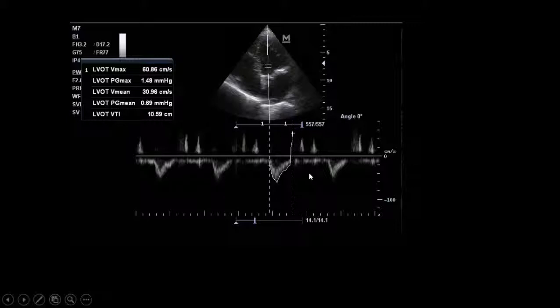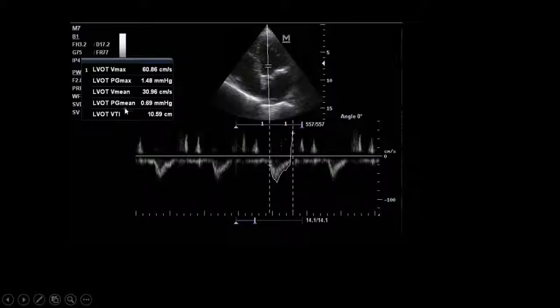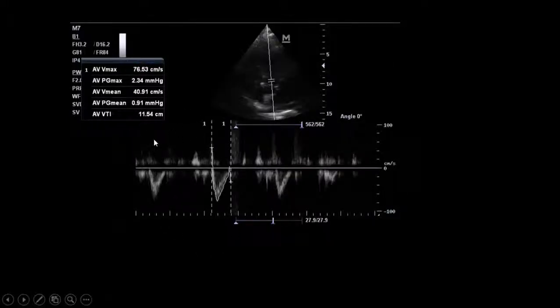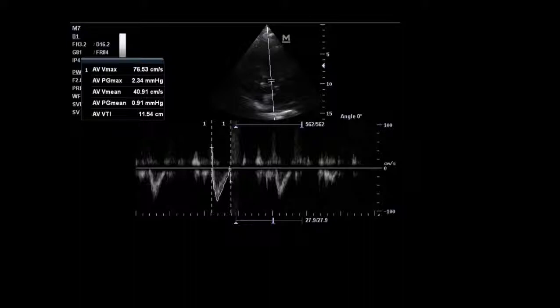To confirm whether this patient needs fluid, we perform a passive leg raising test — it is very safe for this patient. Comparing VTI before and after leg raising, there is no significant increase, indicating the patient is actually full despite the distensible vena cava.